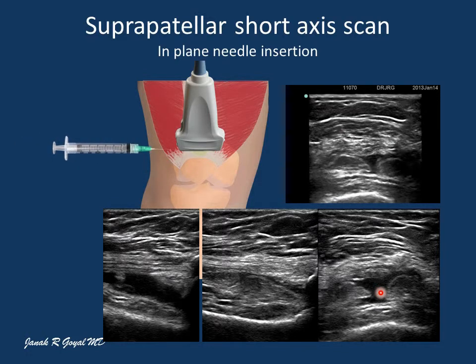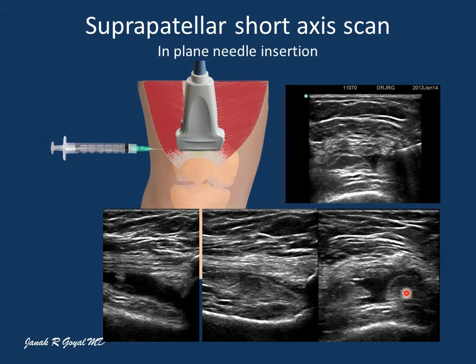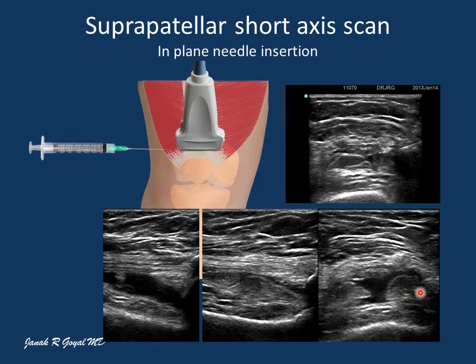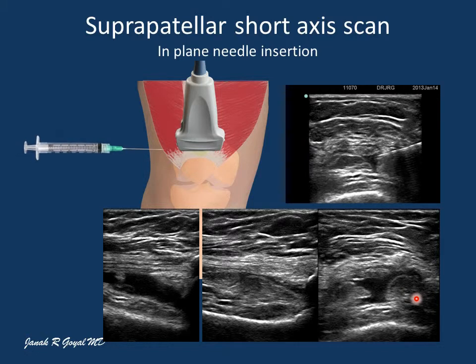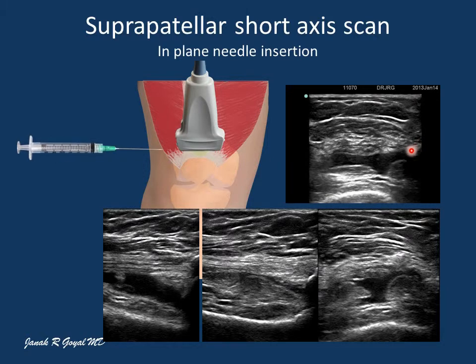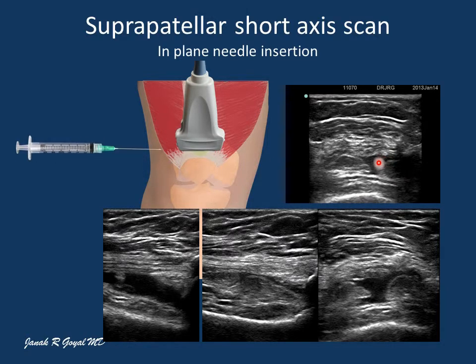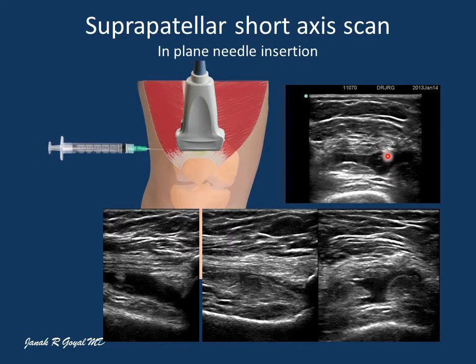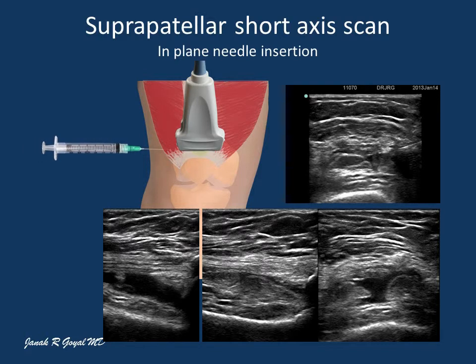So a needle inserted blindly will most likely get stuck in the thick synovial lining, which folds on the needle, making it very difficult to puncture, resulting in the deposit of the injection material just outside the synovial space. So a carefully directed needle through the least thick part of the synovial lining with an in-plane approach results in an accurate injection of the injection material into the joint space, like shown in this image.